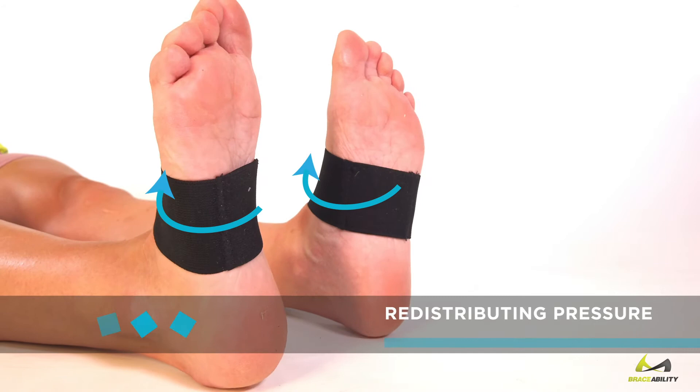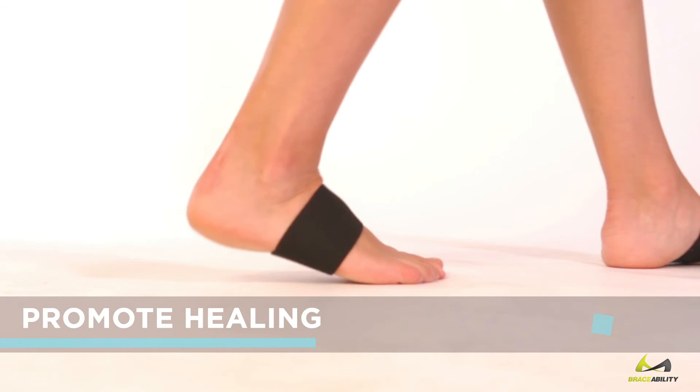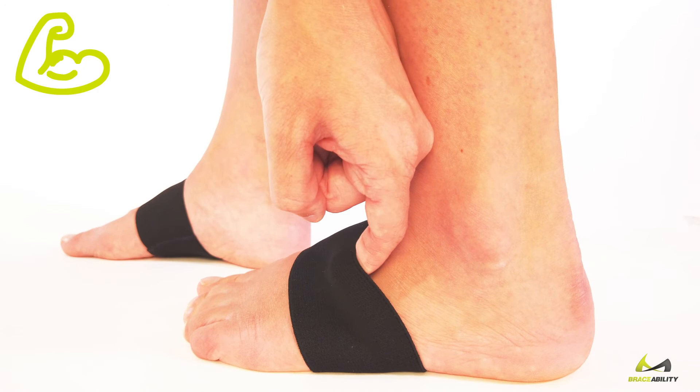These bands lift and support your arches, redistributing pressure across your feet. They promote proper foot alignment, address pronation and supination, reduce muscle strain, and prevent further damage. The medical-grade elastic bands stay in place throughout the day, providing therapeutic compression to promote healing.